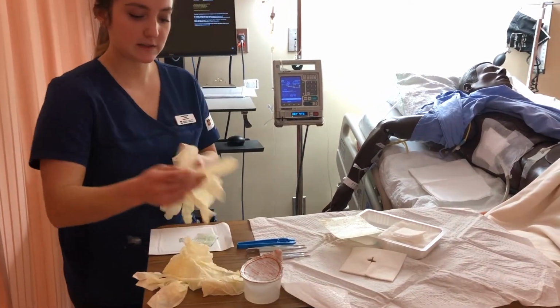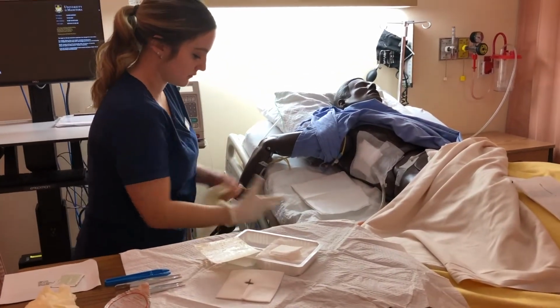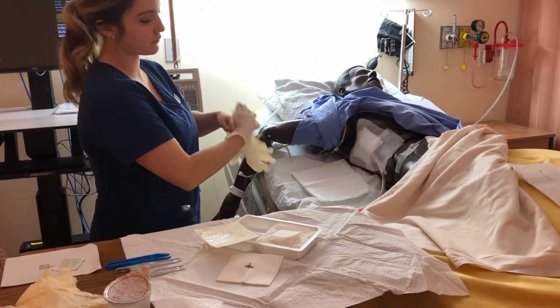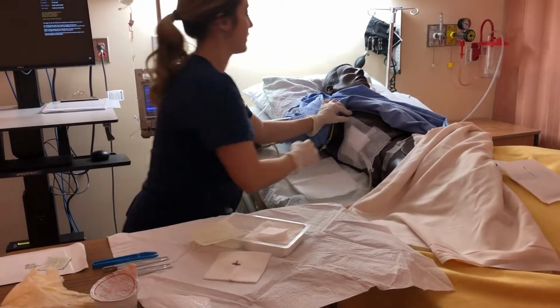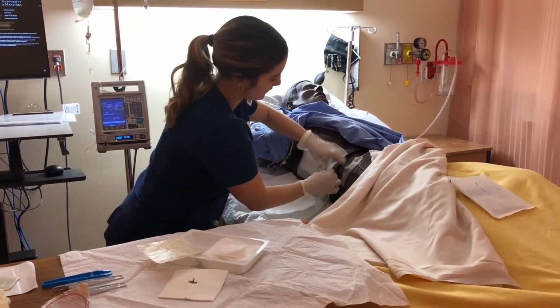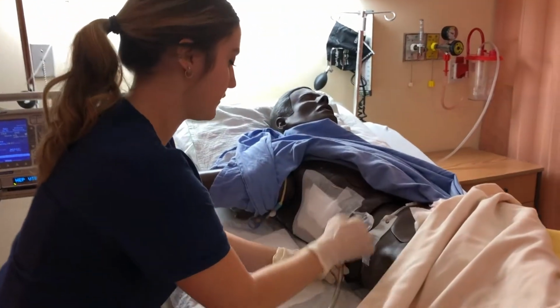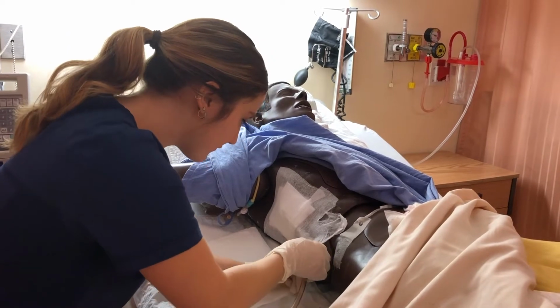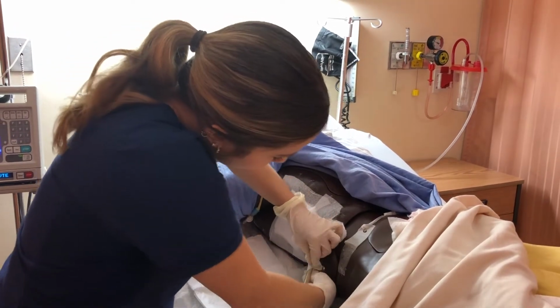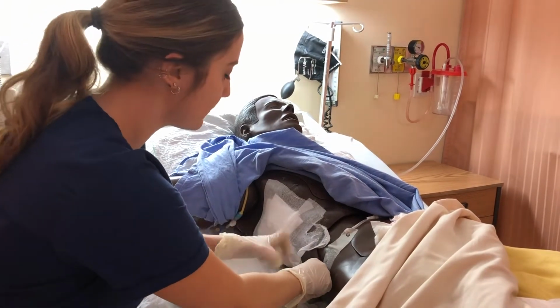So now I'm ready to take the old dressing off and clean. Kind of stabilizing the chest tube while you take off the dressing. It wouldn't be this sticky on a real person.